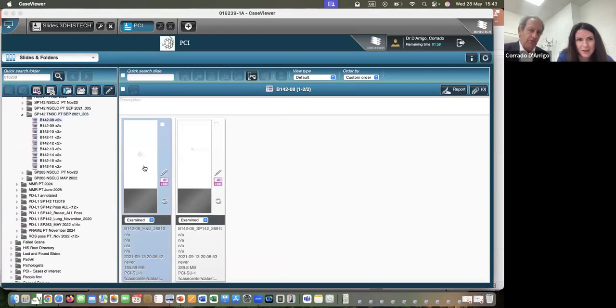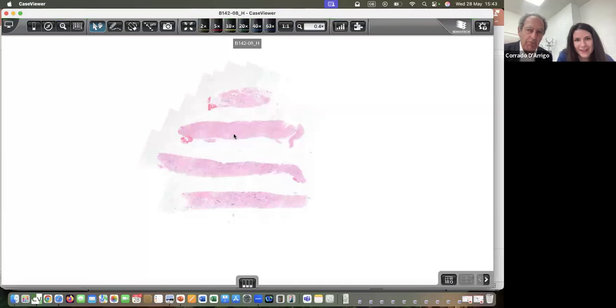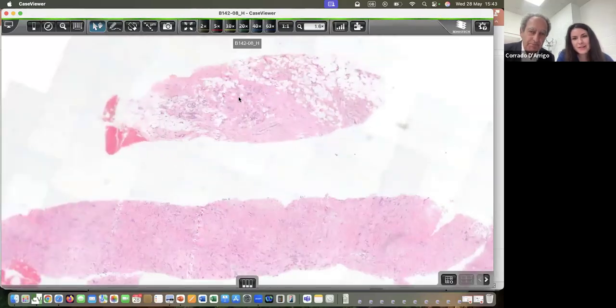Surprise cases. Okay, so yeah, we haven't prepared. Okay, 4 biopsies, very good. For everyone.